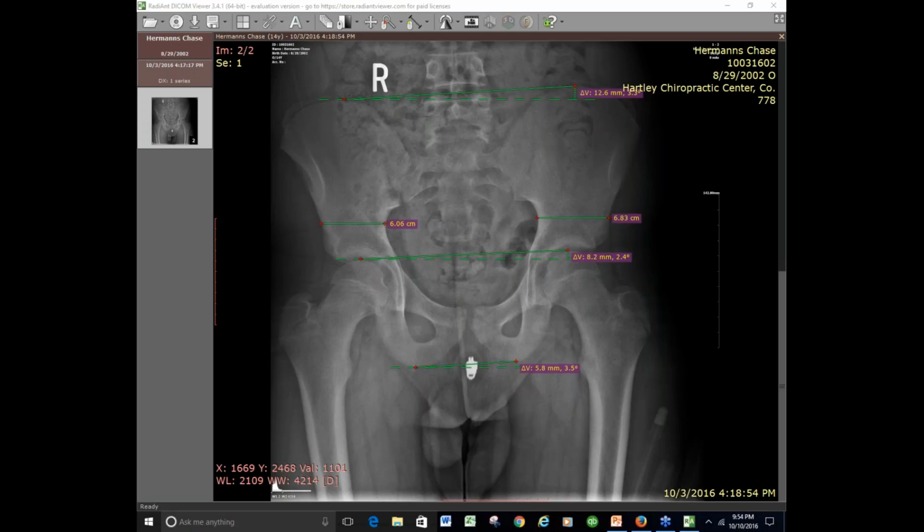Then I see them go to the right, and I see this more often. When they go to the right leg, they usually will get that anterior motion of the PSIS if they have an anterior tendency, and the left side PSIS will rotate posteriorly or downwardly. Oh, interesting. And I see that more with the right leg. It depends upon what sport they're in or what they do, but that's more common for me these days.